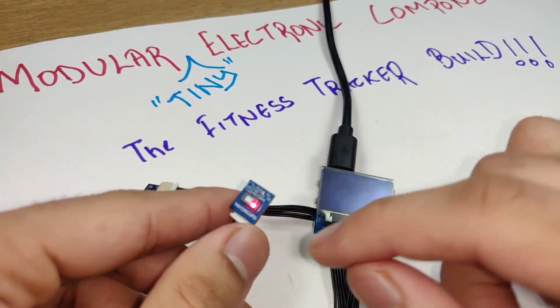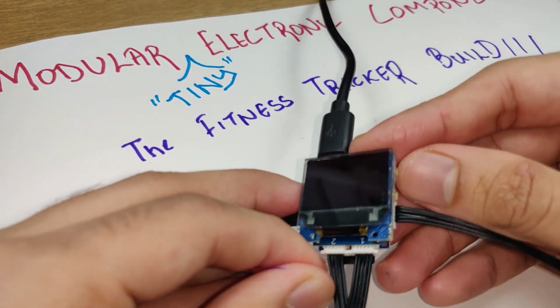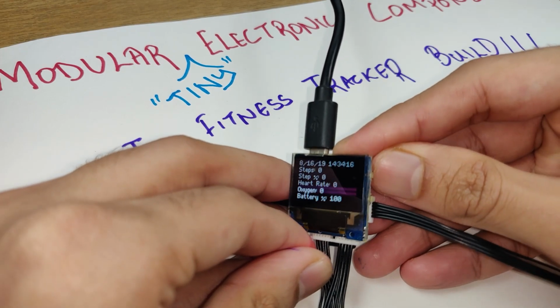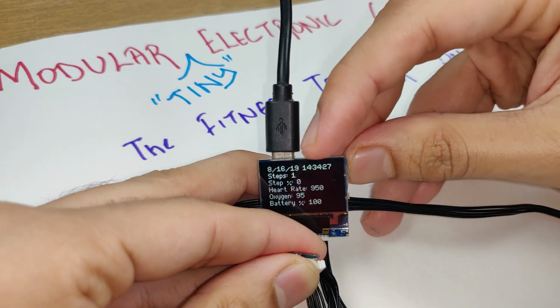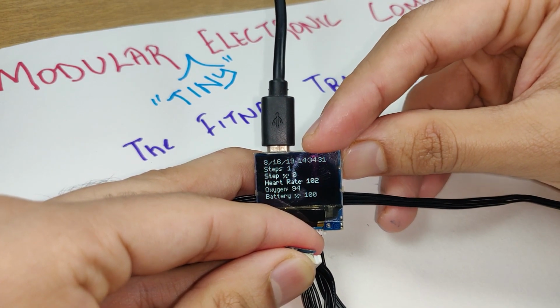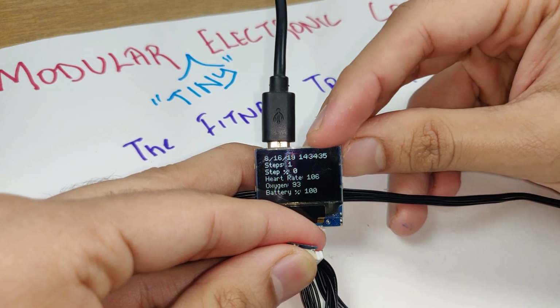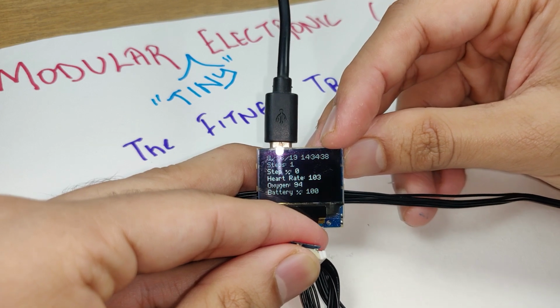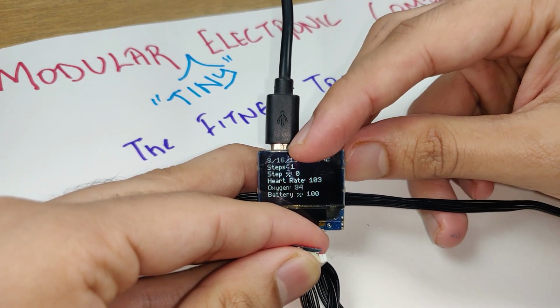So now we see that the oximeter light is red. We'll keep it close to one of our fingers. We need to press any of the 4 buttons to see the display. So we see there's the heart rate because it was once above 100, so we need to consider only the first 2 digits. Right now it's 102. We see that the oxygen is 93, 94. There's no battery attached, so it says the battery percentage as 100. Then there's the date, there's the time, there's the number of steps.